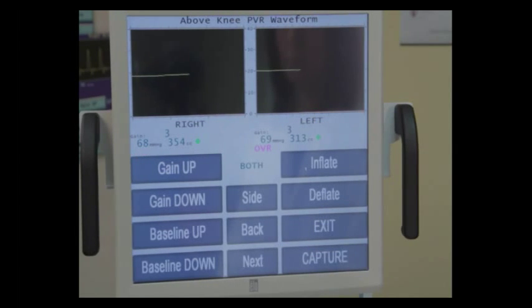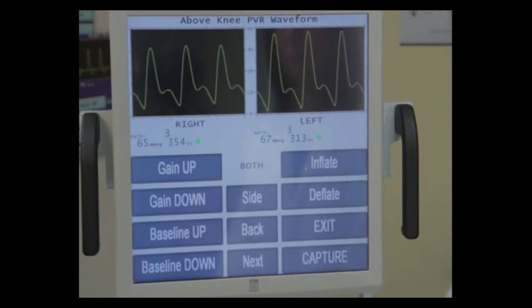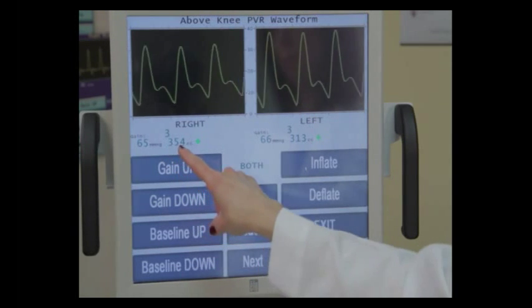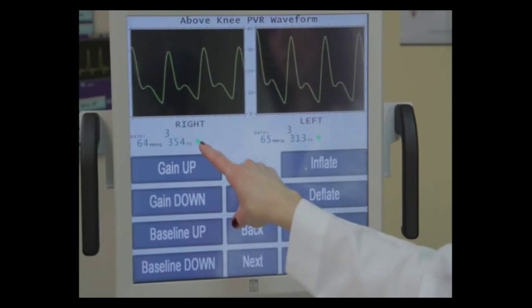Now we're going to look at something a little bit different right now. Besides the pressure and the green diamond indicators, we have two other values. On the right you'll see the number 354. These are how many cc's of air it took to get the cuff to 65 millimeters of mercury.